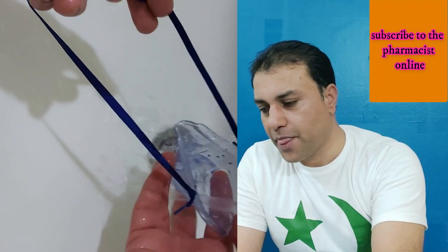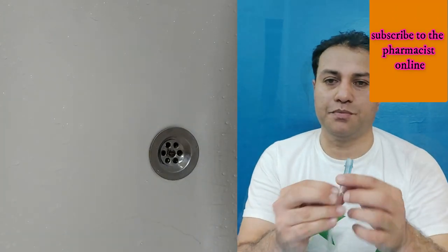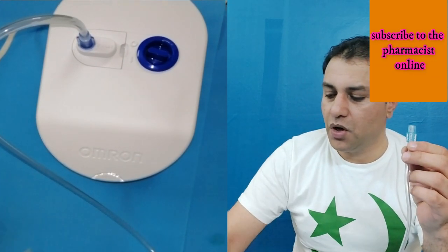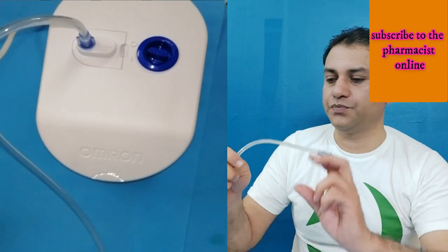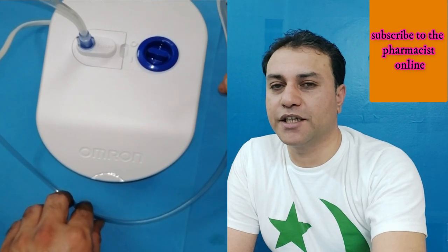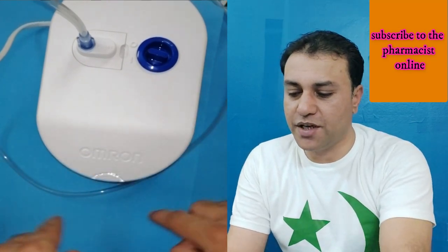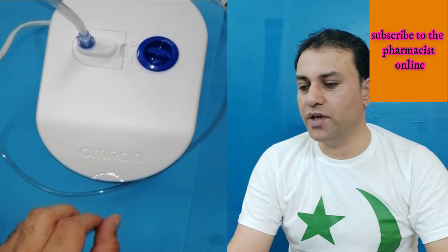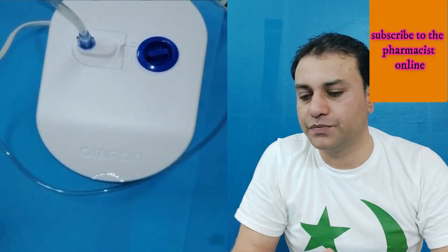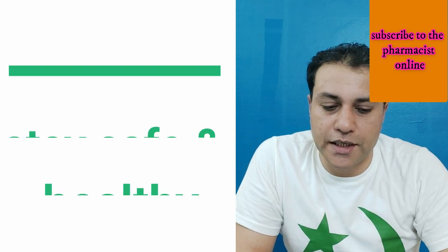Make all washed parts dry on a clean surface. Now for the tube — you may see droplets inside the tube. To clean it, connect the tube to the compressor without the medication container and turn on the device. Any droplets inside will be pushed out and the tube will be clean. Run it for 30 seconds to 1 minute.